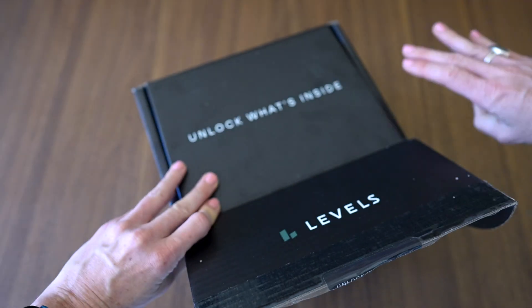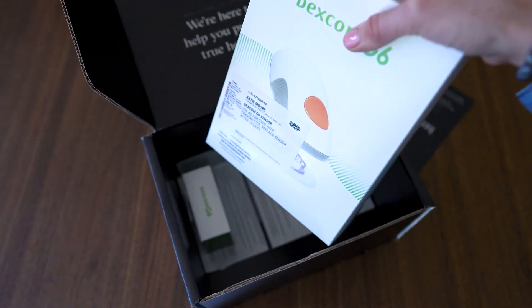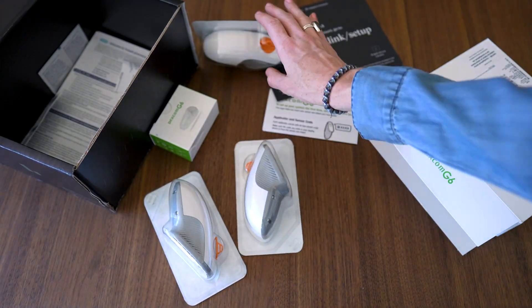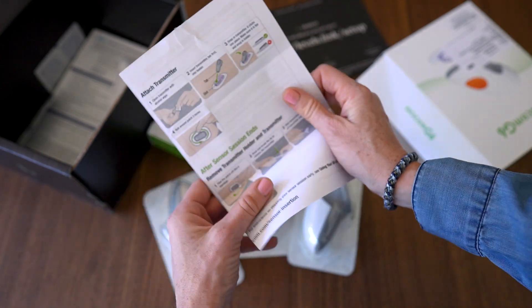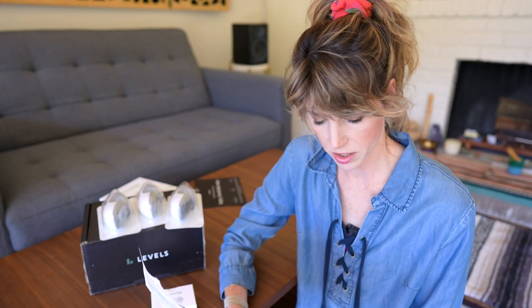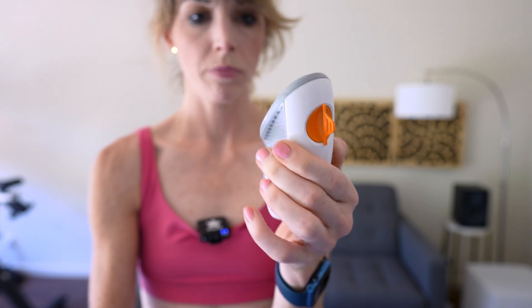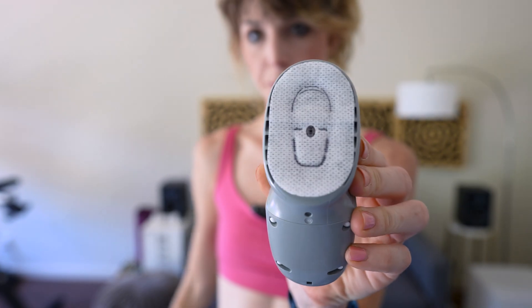Now, don't be alarmed when you open up the Levels box with your Dexcom to find just a ton of stuff. We're talking three applicators, a transmitter, and really all the medical paperwork you could ever ask for in life. So step one, as per usual, wash and dry your hands. Now this is not medical advice — really just reading this right off the sheet. But for the most part, the insertion process itself is fairly straightforward. It's very much like the Libre.